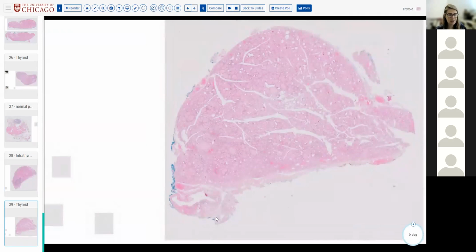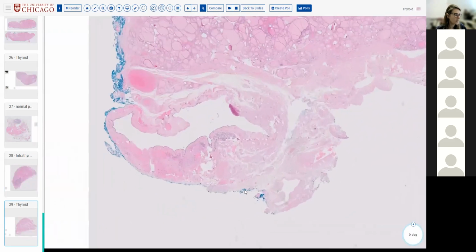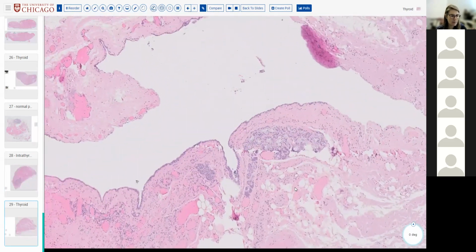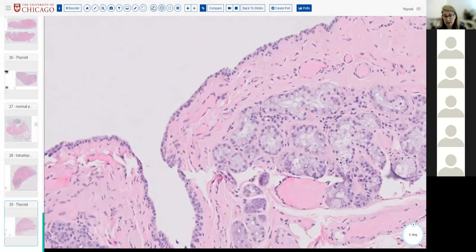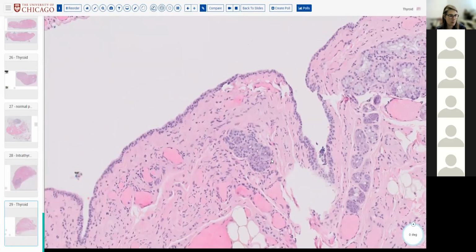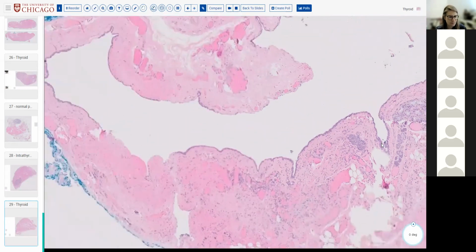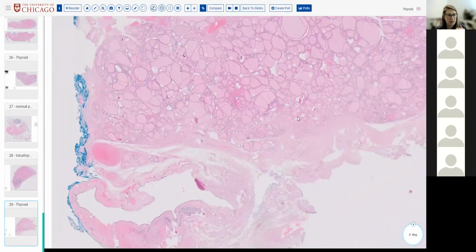The other thing that you can a lot of times see in association with thyroid and parathyroid in the neck are these things. So one of them are salivary type glands, right? So serous, mucinous, seromucinous, again, because of the branchial cleft development. So you here see seromucinous glands with a little duct, and this structure is right butted up against the thyroid.